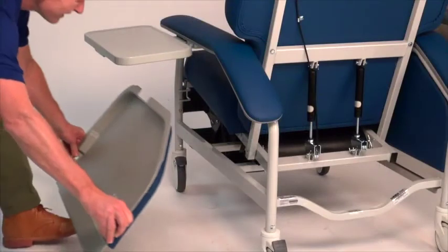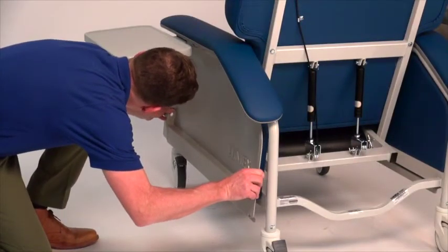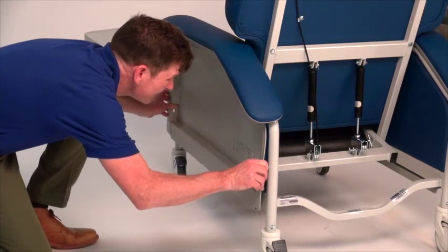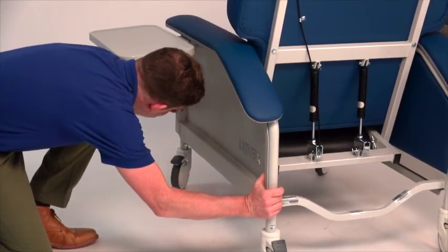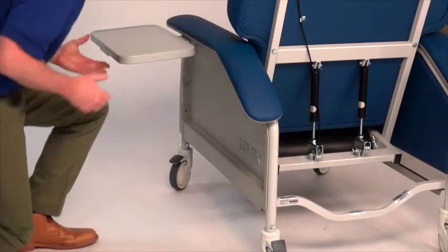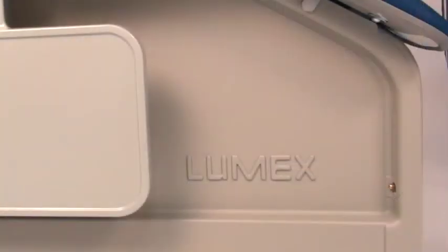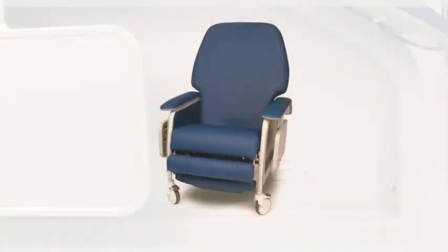Insert the side panel into the recliner frame by locating the tabs underneath the armrest. Make sure the side panel is properly aligned and that the top edge is behind the locking tabs. Press the side panel into the frame sides. Make sure that both push buttons are protruding through the side panel edge to ensure the side panel is locked into place. Your Lumex recliner is now ready to use.